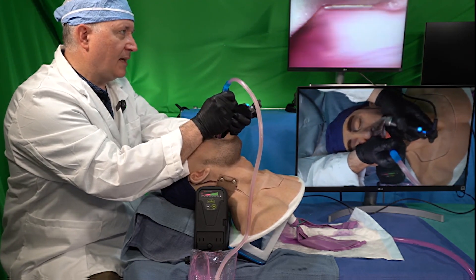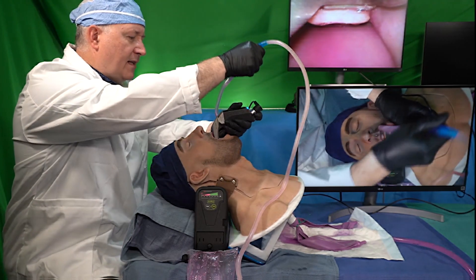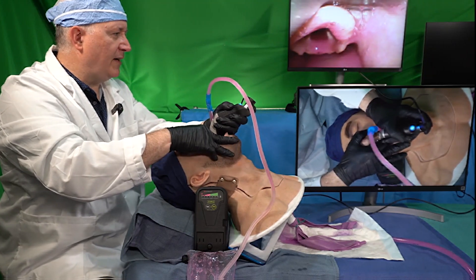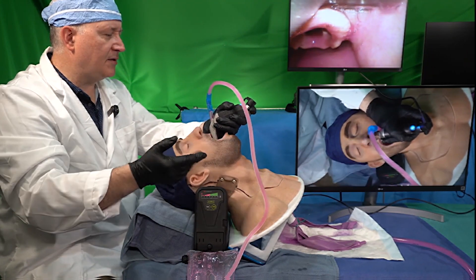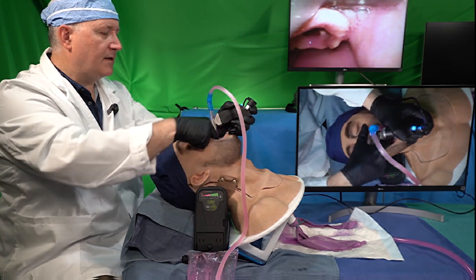I can see my epiglottis — it's a little bit slippery in there. I'm going to go ahead and SALAD park this catheter to the left now. My assistant Bob is going to go ahead and re-contaminate the airway in the simulation. What I've done here is I've created room for tracheal tube delivery by poking my finger into the mouth.